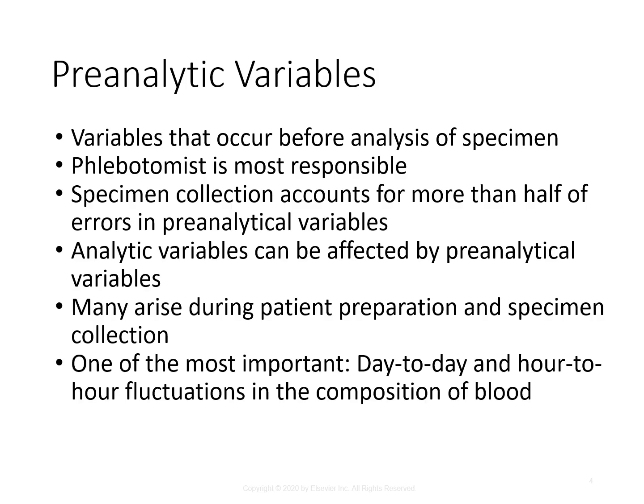All right, so pre-analytical variables. These are variables that occur before the specimen is tested. A variable is any factor that can be measured or counted that will affect the outcome of the test results and ultimately patient care. The phlebotomist is actually the most responsible for pre-analytical variables.